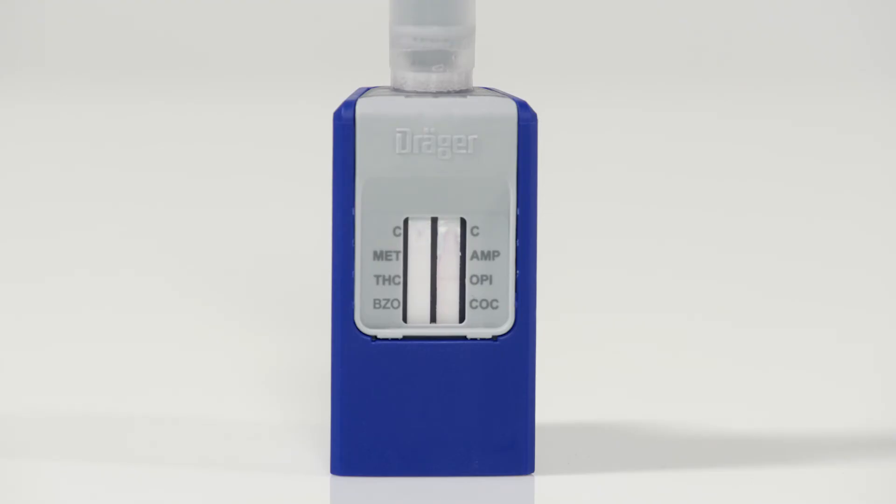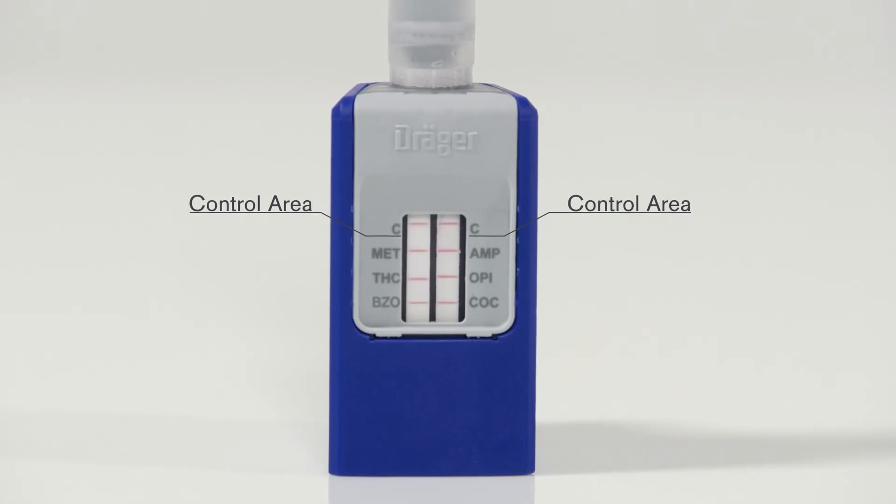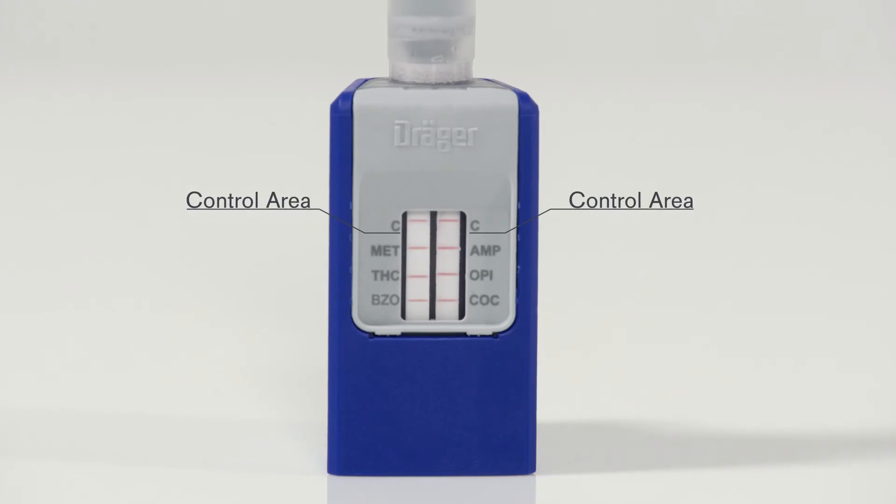If red lines appear in the viewing window, in the upper control area, labeled with C, and in the area below it showing the substances to be tested, then the test is valid and negative. This means none of the six substances have been identified.